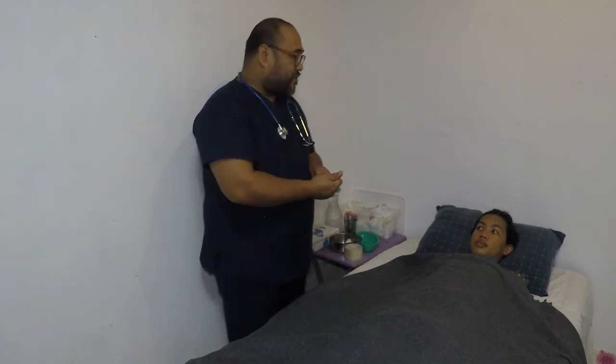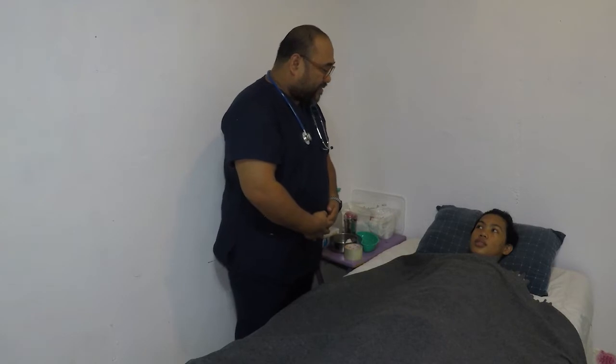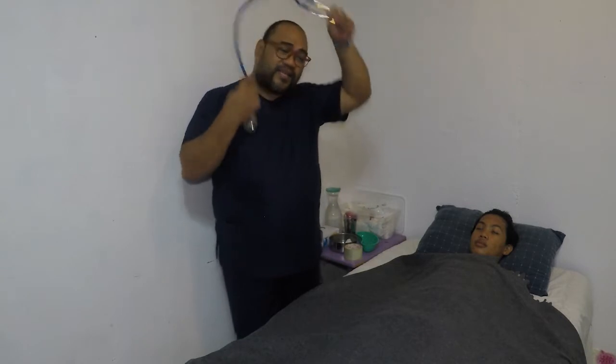Okay? So then, we have to gather the equipment because organization provides accurate scale performance. So, your name again, sir? Andrea, and your birthday? Okay, thank you. Assess the client's abdomen. By assessment, it will determine the presence of bowel sounds and amount of abdominal distension. So we'll be checking by using this stethoscope.